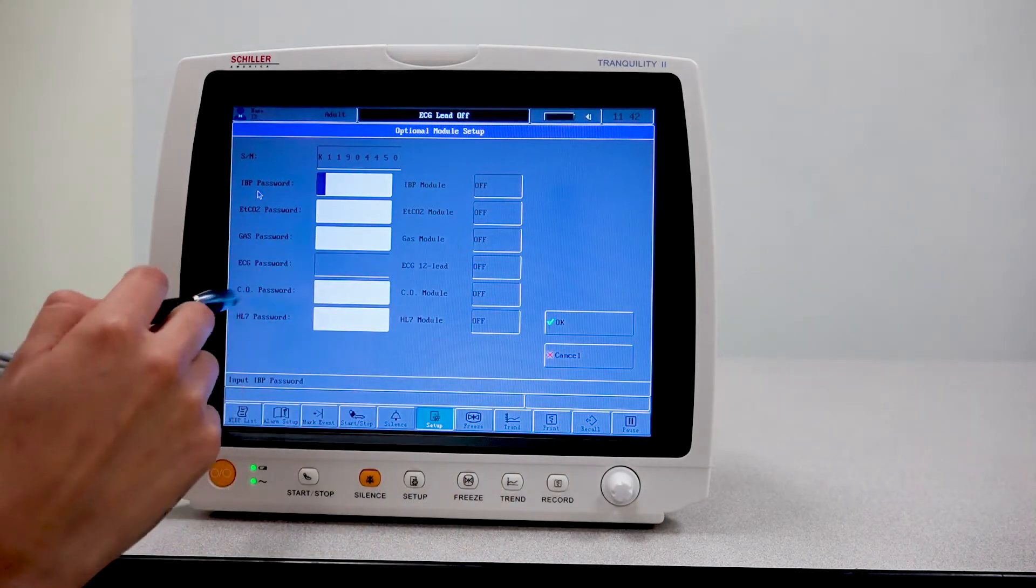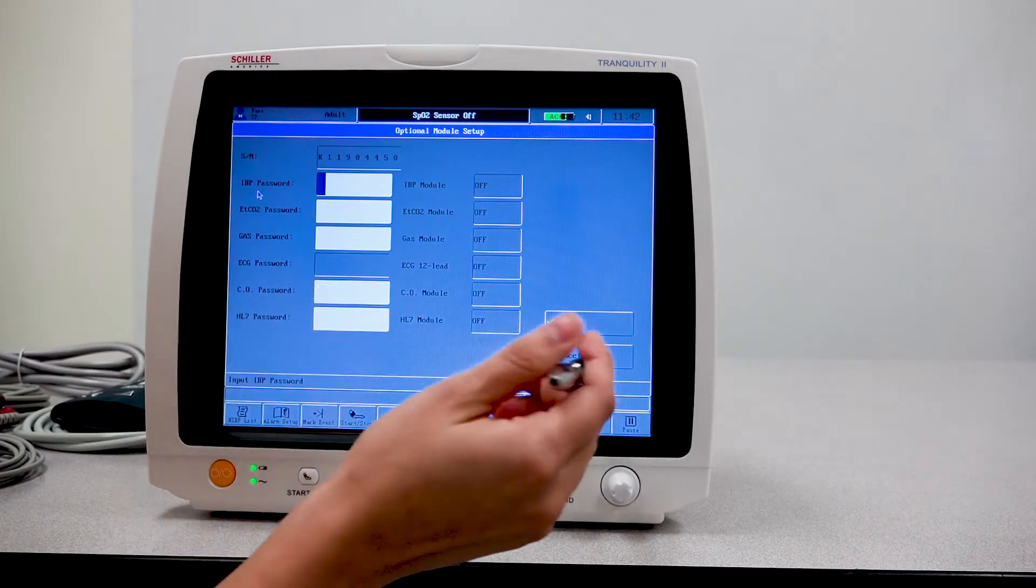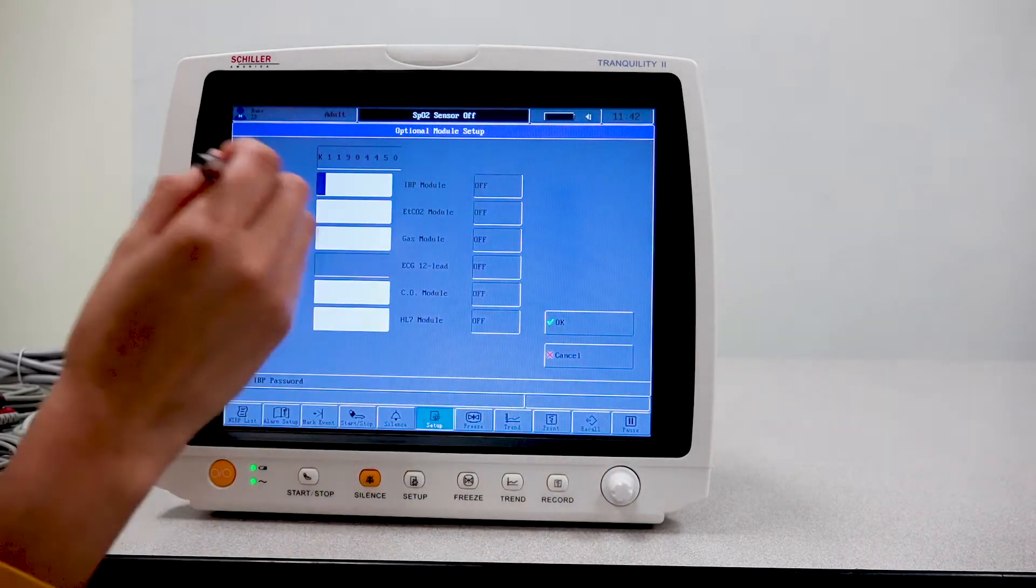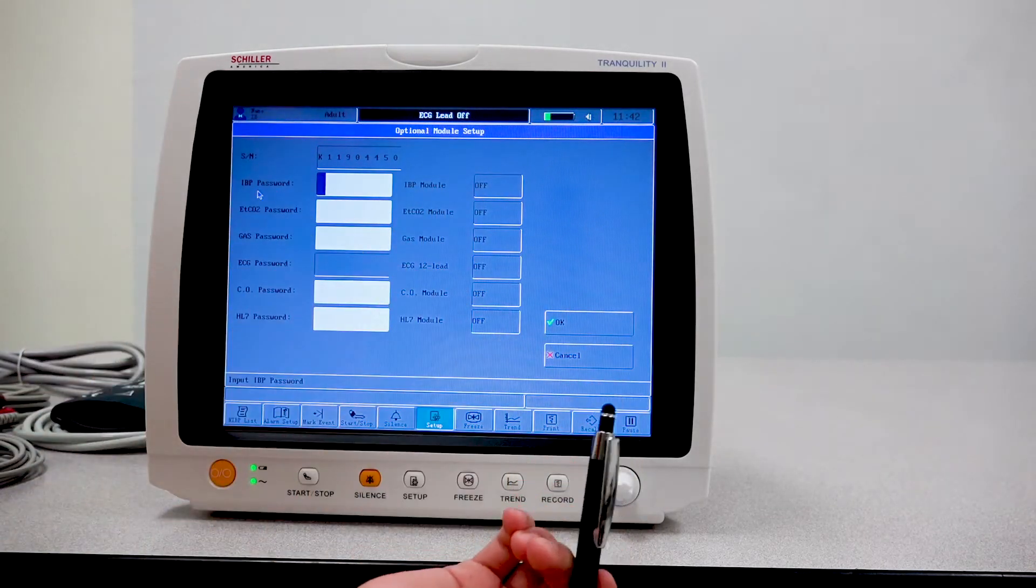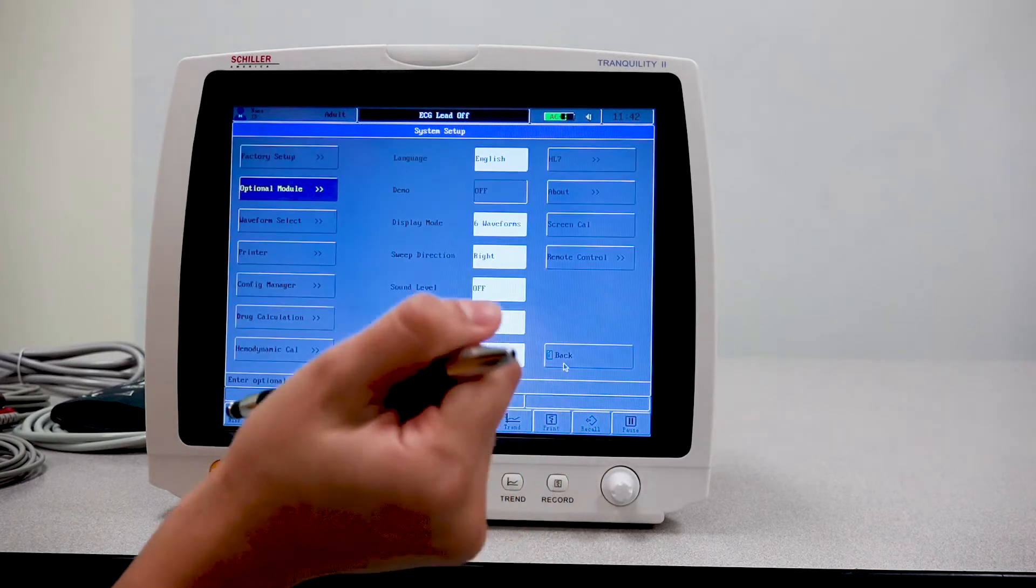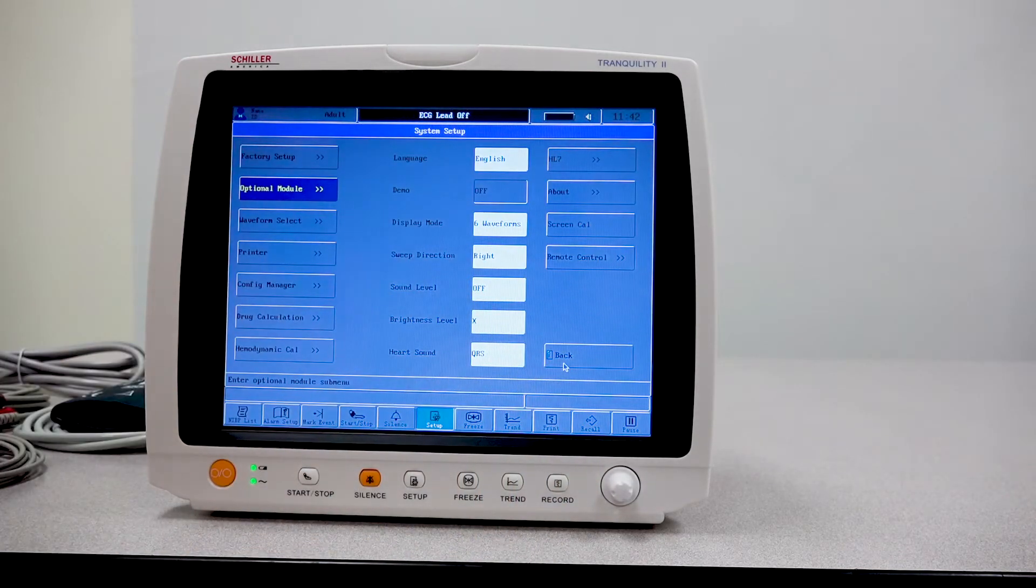You also have the HL7 capability. You'll be able to enter password here and enable it if that's what you want. Let's press cancel because we made no changes.